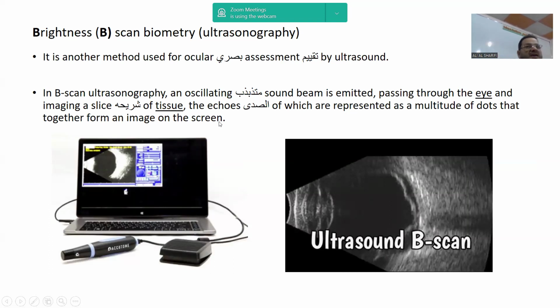That means, let's say we have incident waves and reflected waves. From the reflected waves, we can get the specific tissue figure. By using this technique, researchers can plot helpful images in pregnancy and other situations like that. This is the main rule researchers use.